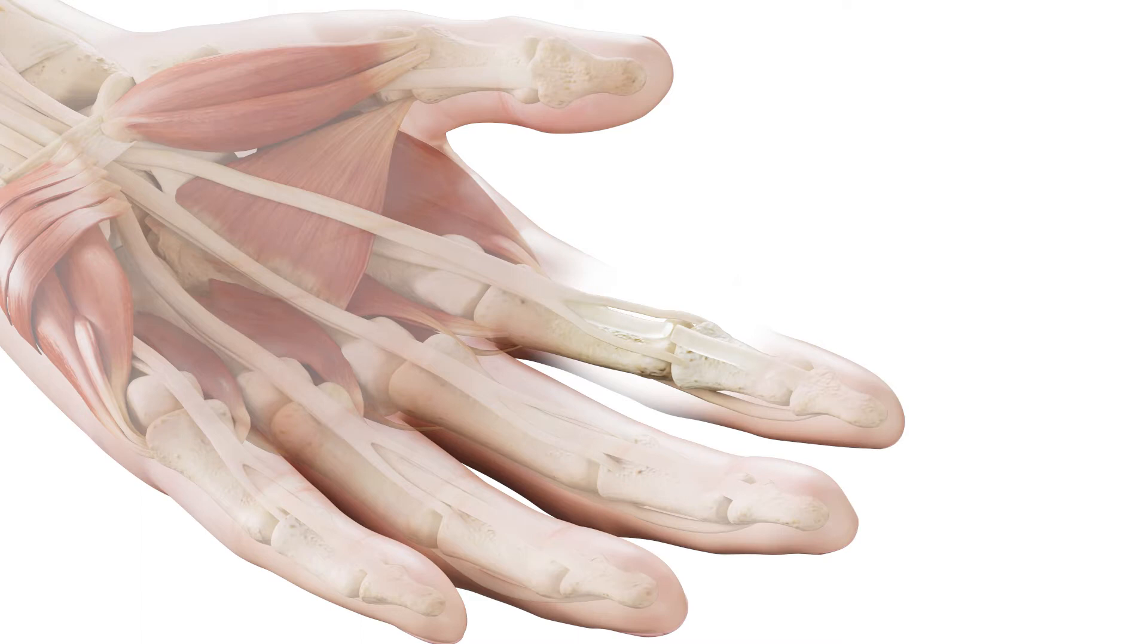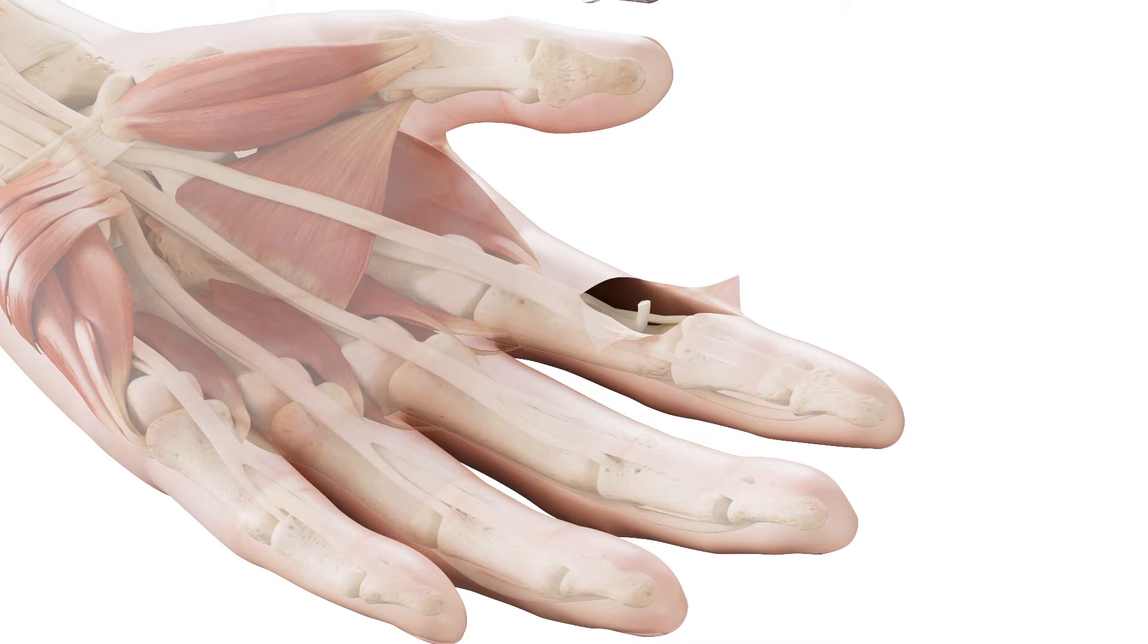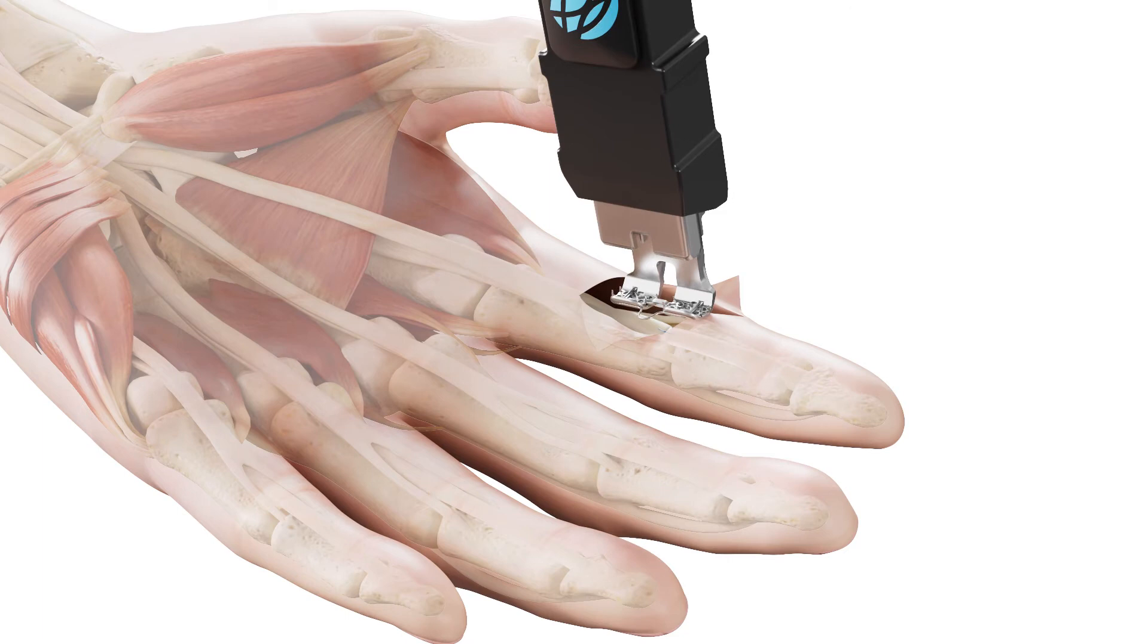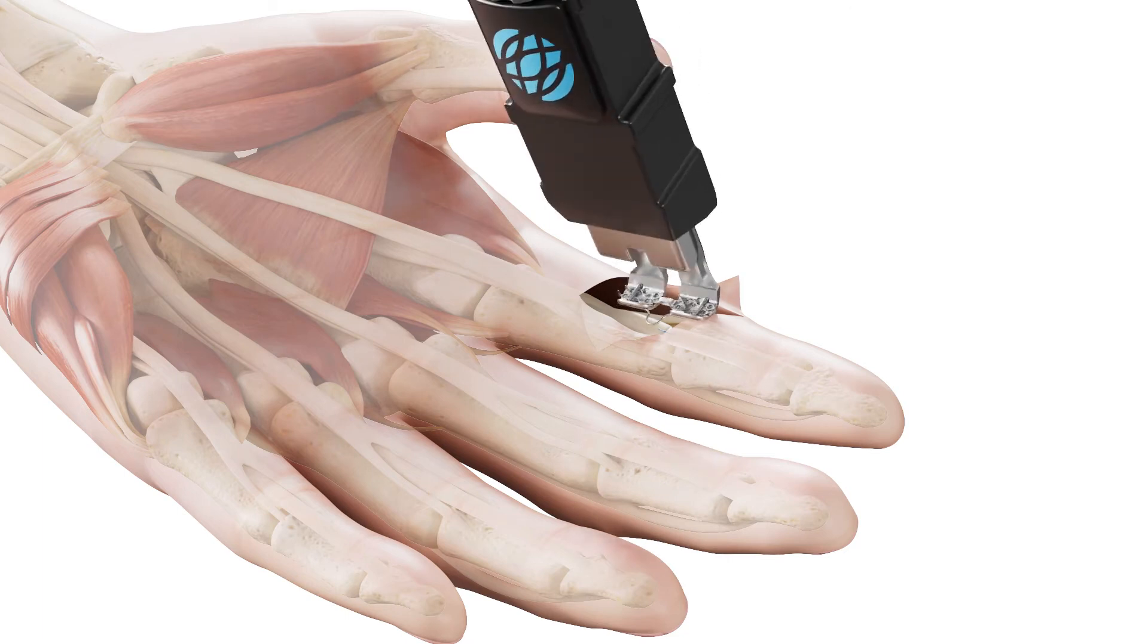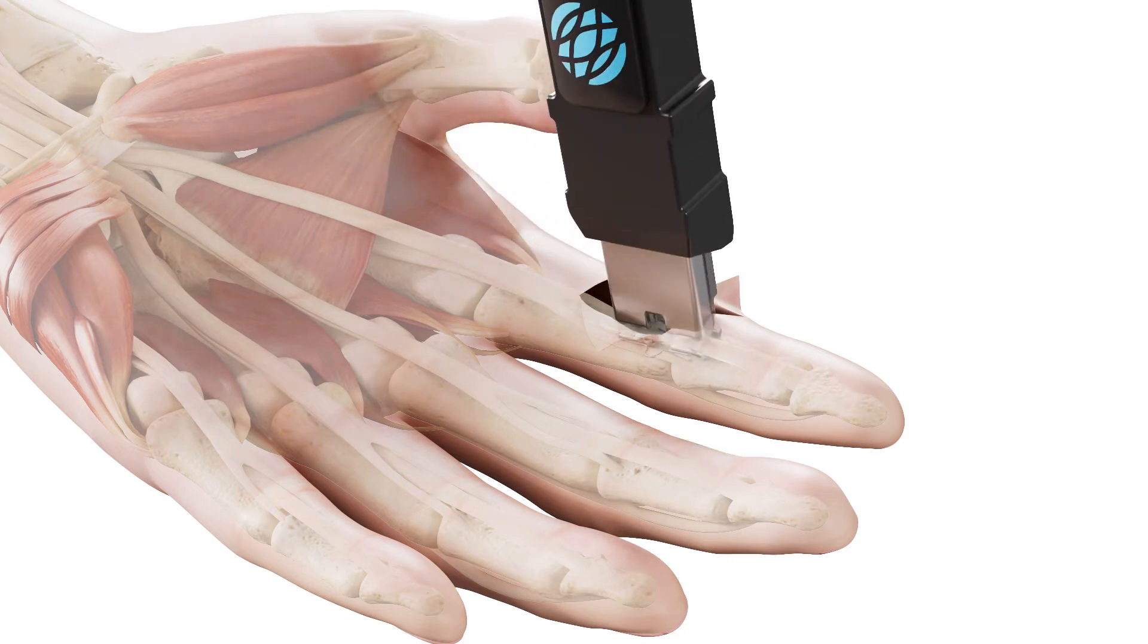Approach the lacerated tendon using a preferred surgical technique. Create an access point in the sheath by creating a 2cm incision over the laceration. Retrieve tendon ends using a standard technique and approximate the ends using two epitendinous corner sutures or a preferred alternative approximation technique. You are now ready to use the Connections TR Tendon Repair System.